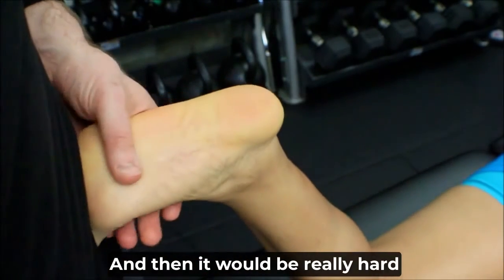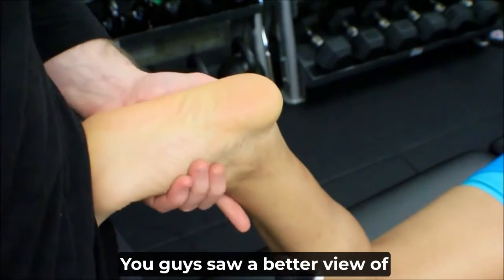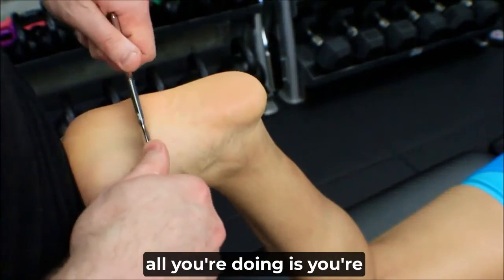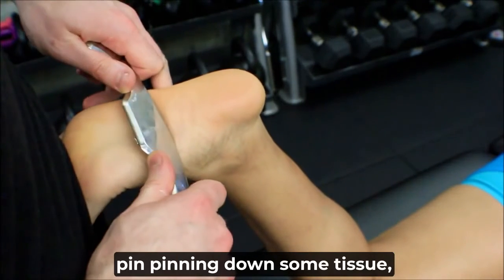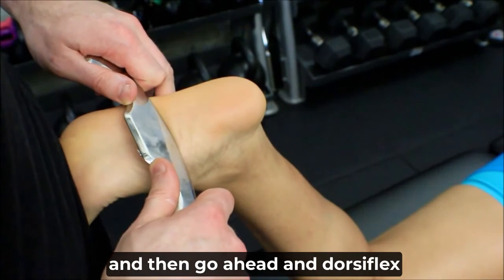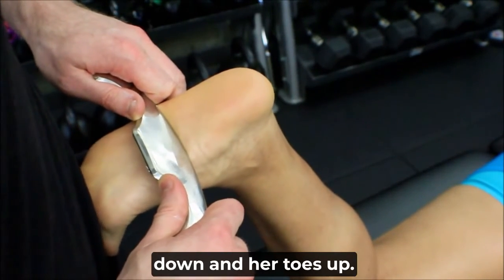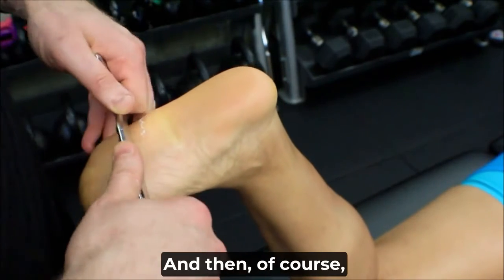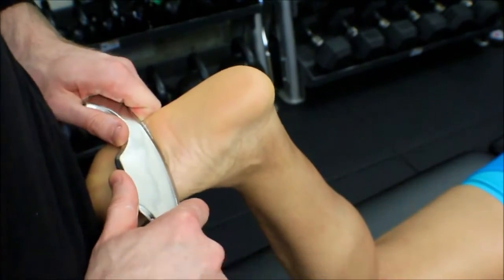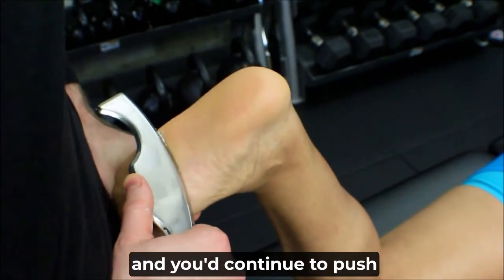And then it would be really hard to show you guys in this position how I would do the pin and stretch technique. You guys saw a better view of that in the full body view. But just remember, all you're doing is you're starting this way, pinning down some tissue, going to your 30-degree angle, and then go ahead and dorsiflex for me, Sonia. Then having her pull her foot down and her toes up. And then of course you could add overpressure. So you're pinning down this way, and you guys can see the depth that I'm getting into the tissue there with the tool, and you'd continue to push through.